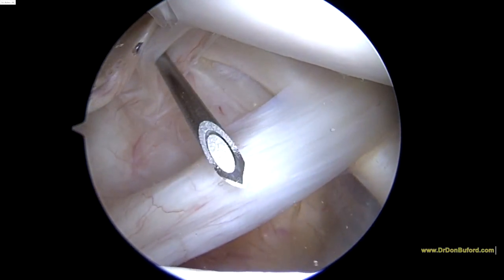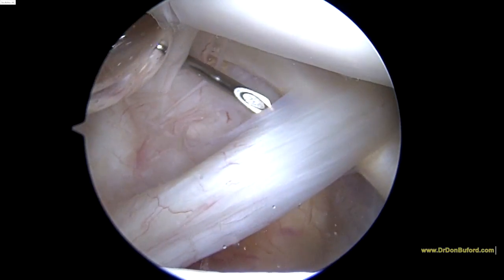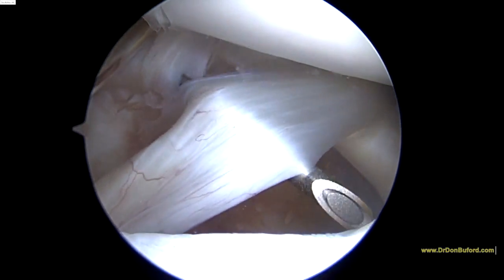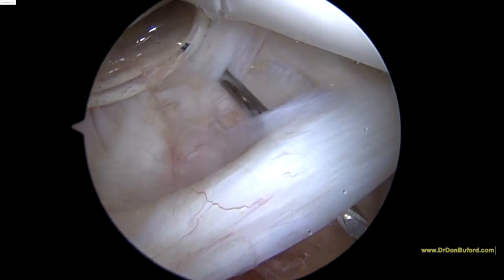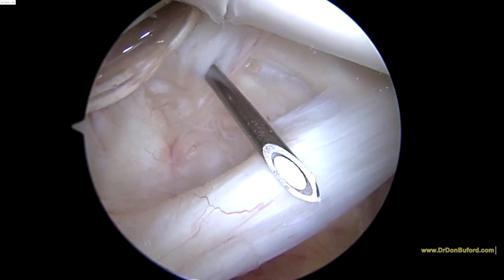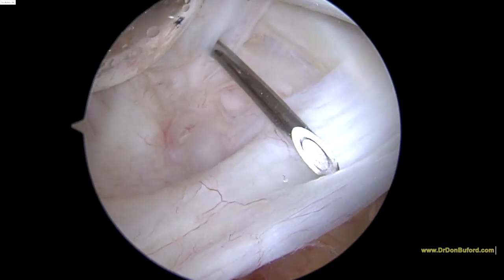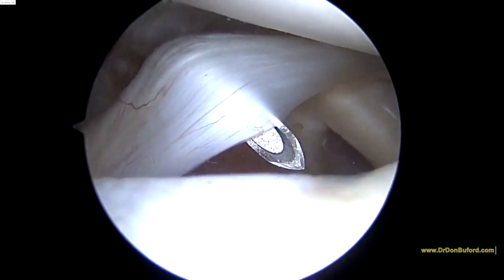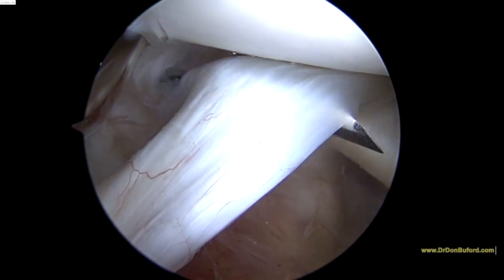This is the middle glenohumeral ligament. Now this is an 18 gauge needle, just to give you an idea. You can see how wispy this middle glenohumeral ligament is — that's the entire ligament. So at least in this patient, this would not be a structure we could target because the needle would just pass right through it, as you see.